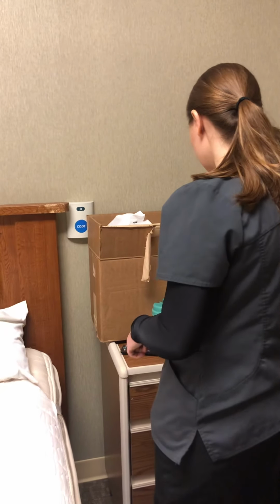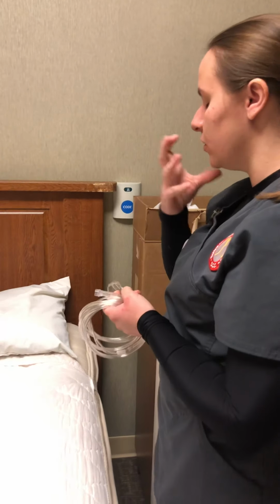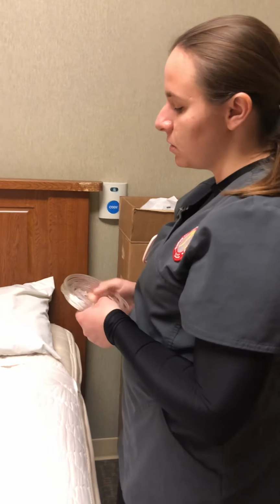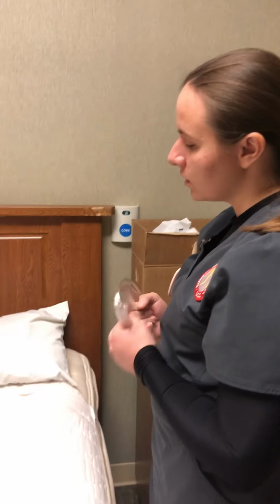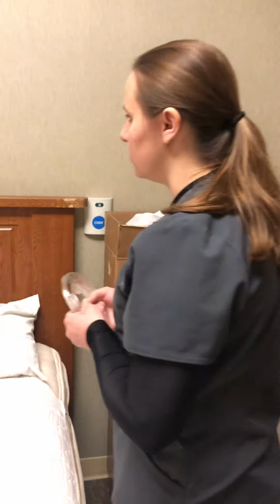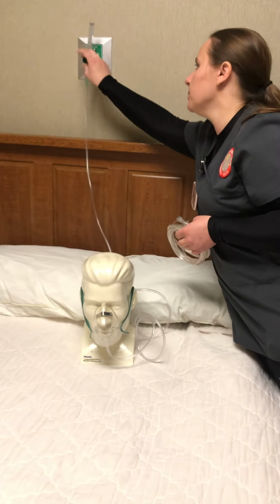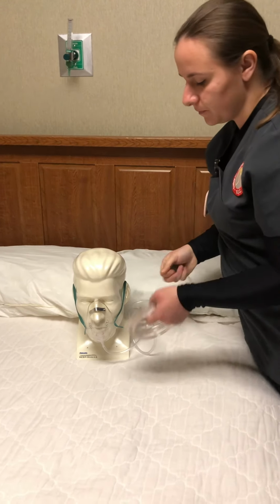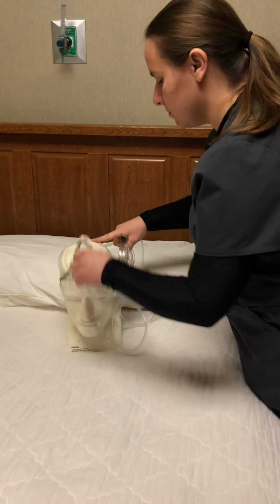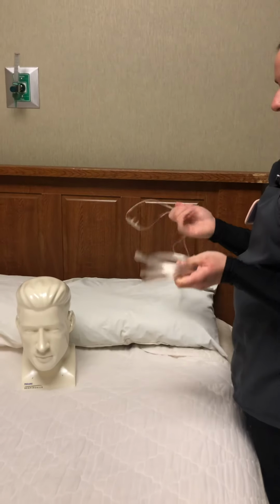And that is a nasal cannula. So it's going to be going in your nose instead of just covering your face. So it'll be more comfortable, especially when you're sitting here and being able to talk to any visitors that may come and see you. So I'm going to just shut this one off and I'm going to change you right over, okay? So after I get the vital signs, I'll just change them real quick. And I would remove this from them very carefully, not to pinch them. Set that off to the side just in case we need to use it again.